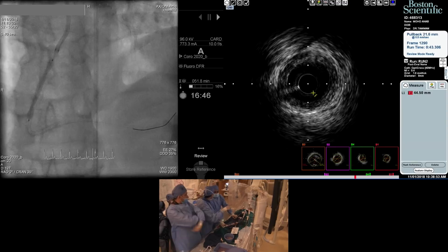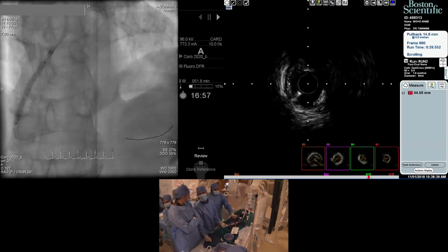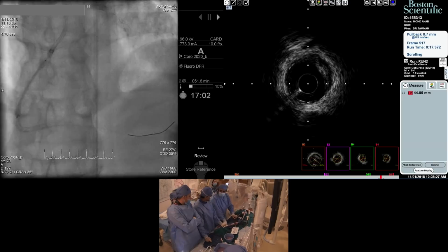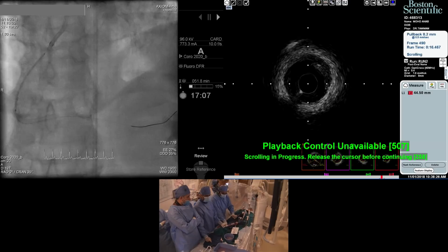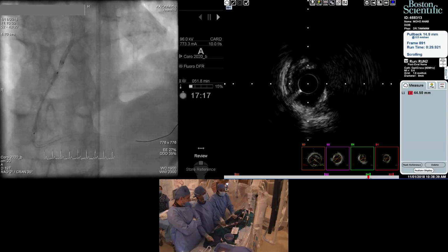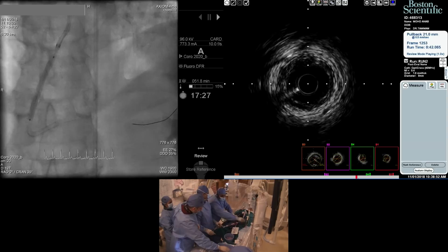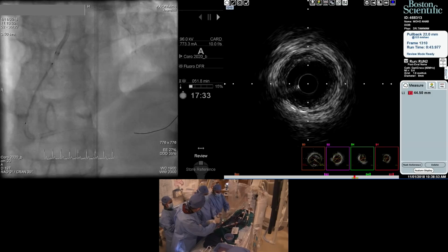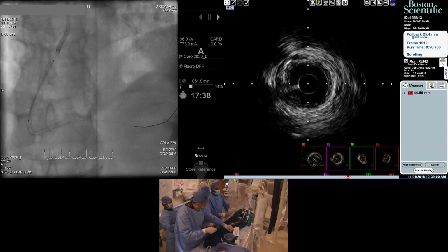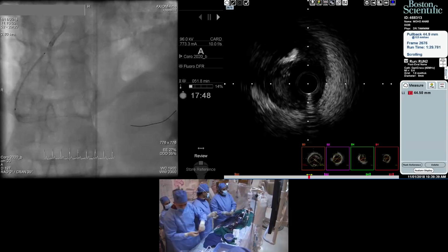So now we will go back just around the crux. So we go more distally. And this is where we are entering the distal right. Yeah, I agree. You already have this one. Okay, so I believe we should just put an ostial stent, according to the IVUS, and then follow up the patient. We already have a low pressure balloon dilatation there, and we have a drug-eluting balloon distally. So I believe it will improve.